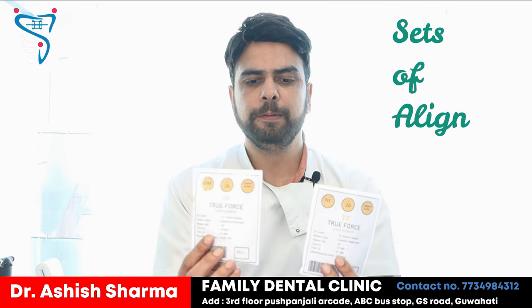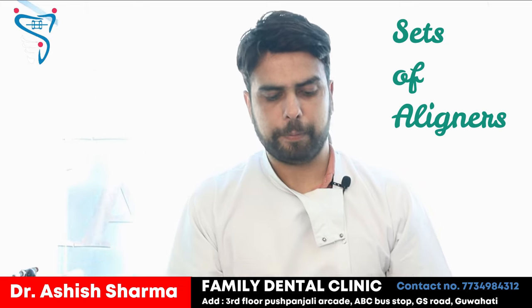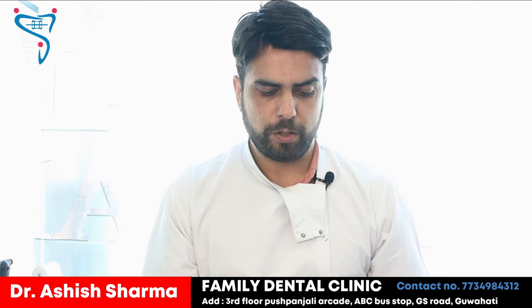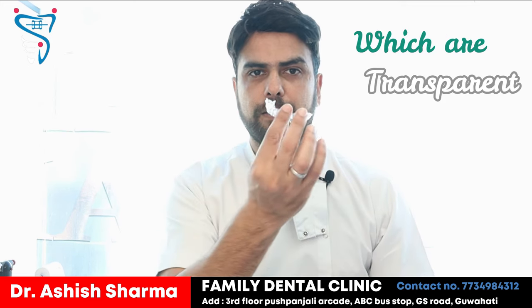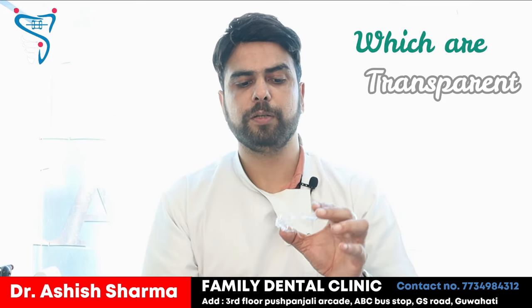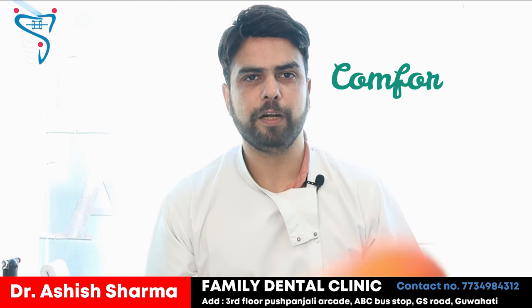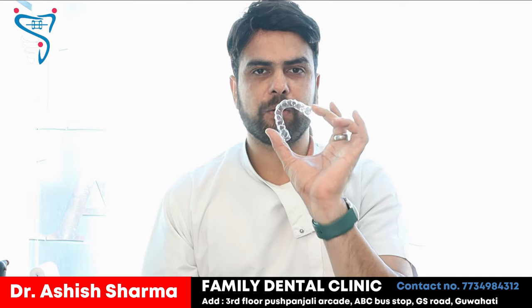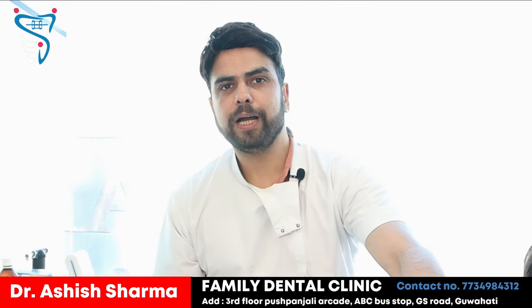These are the sets which have come to us. They are thin plastic trays which are very thin and transparent. They are not at all visible, they are very soft, flexible, and comfortable to the mouth. Once we started with these aligners — these are called aligners.